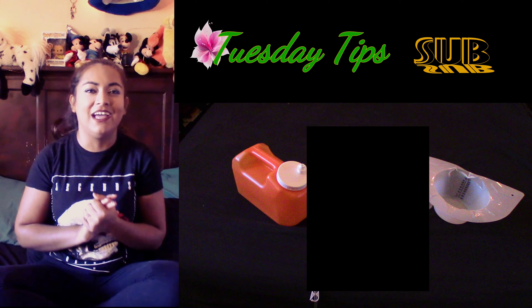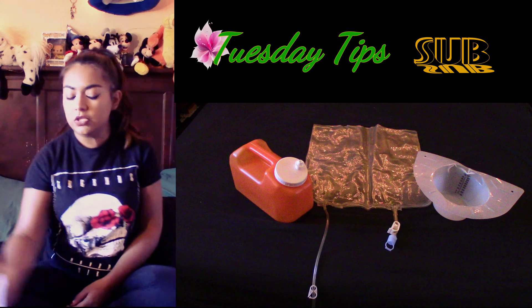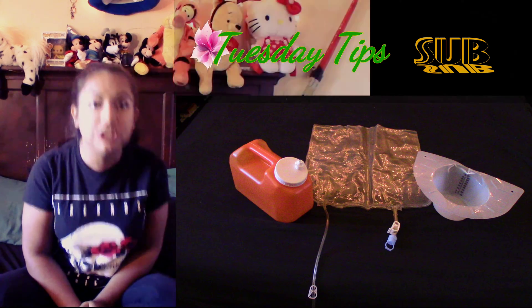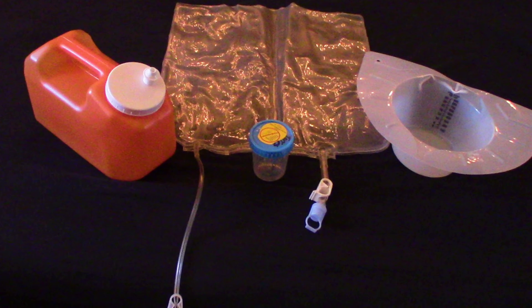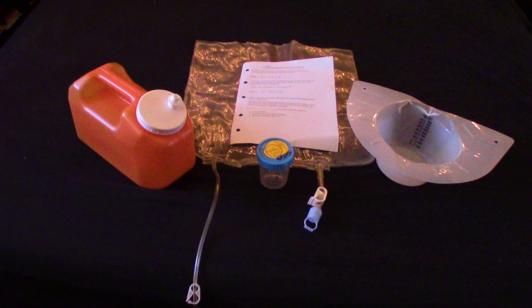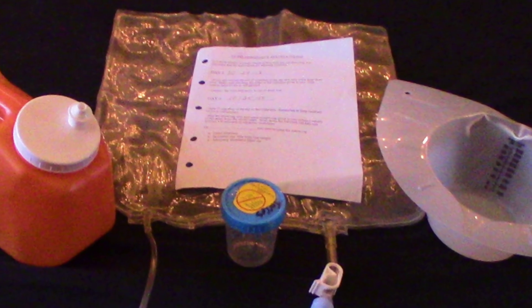If you put this container on the toilet the day before, you're going to hear it when the urine hits it and you'll remember you're supposed to be doing your adequacy. There's also a drain bag — it connects to the end of your drain line on the machine. I also received this container to sample the dialysis fluid after my dialysis treatment is over. The last thing I get is a piece of paper, which helps fill in the blanks.